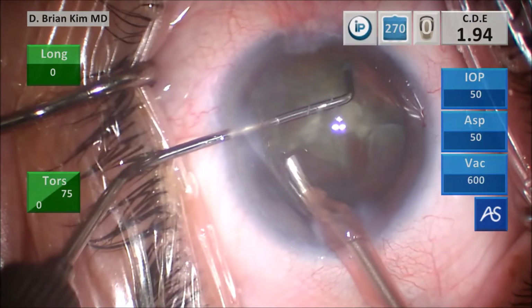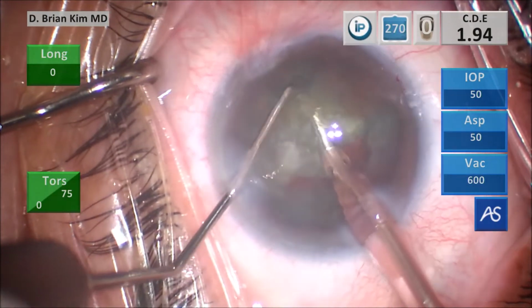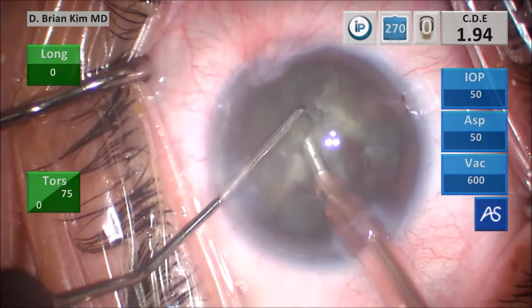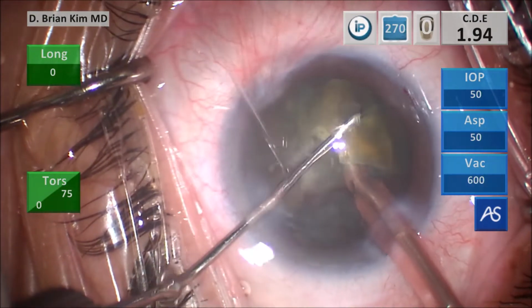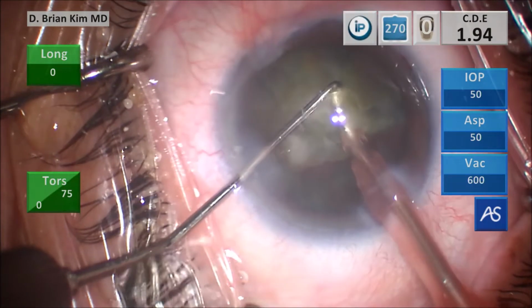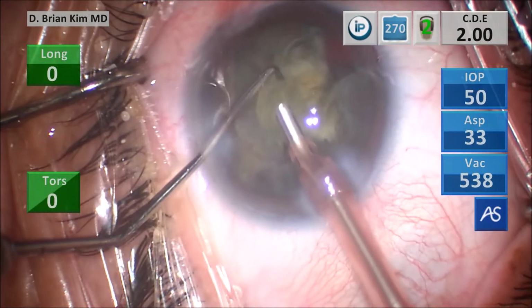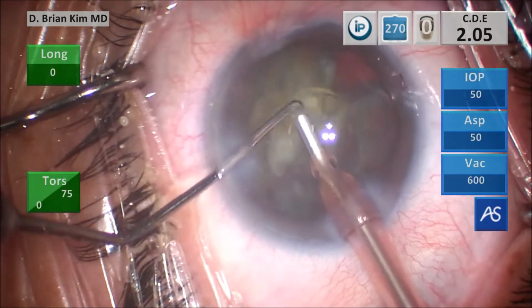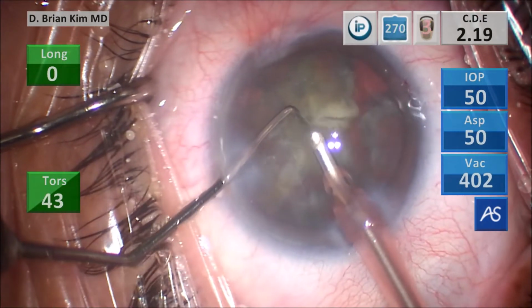Turning that second heminucleus in front of me, placing the chopper around the lens, pulling it centrally toward the phaco tip and fracturing the lens in half. Doing the same maneuver around the third quadrant. You can see how controlled that chopping of the lens is. Once I've chopped that lens, again, the chopper against the phaco tip, which acts like a cutting board or a chopping block, I'm able to pull that fragment up, crush the lens between the instruments into smaller pieces, and emulsify the lens piece.